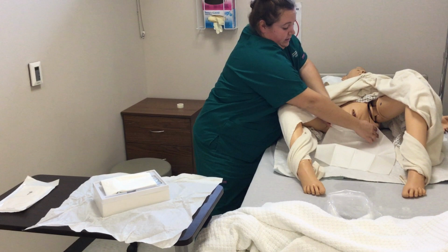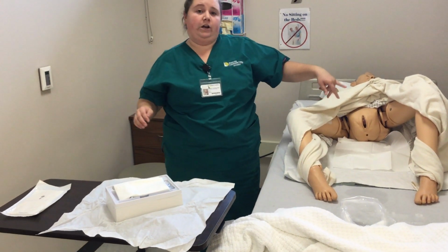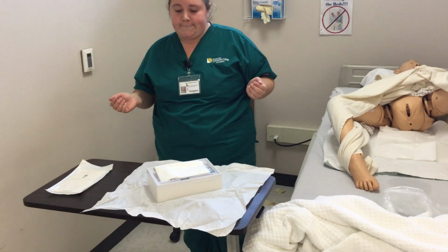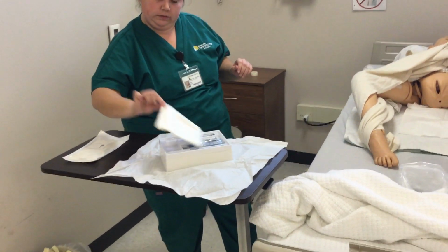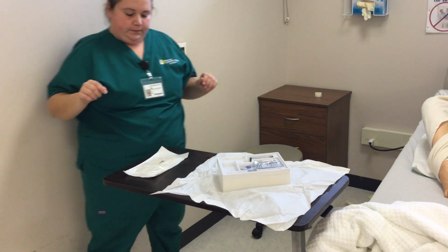Keeping my sterile field in vision. When I put that under, I'm going to ask the patient to raise their hips, if possible. And then I'm going to take this out. I'm going to position the patient and put on gloves.